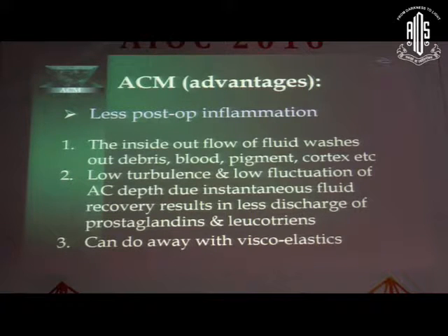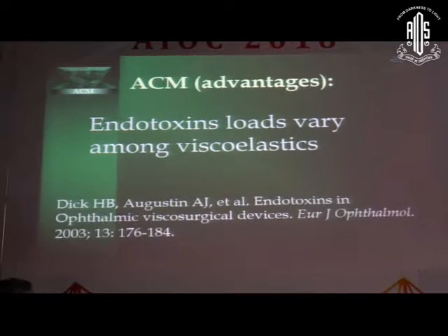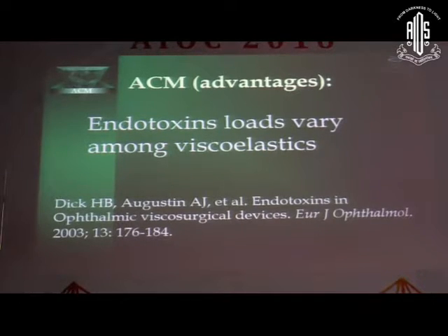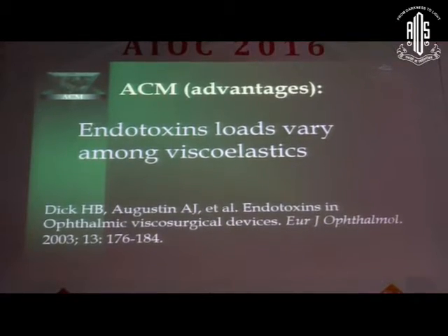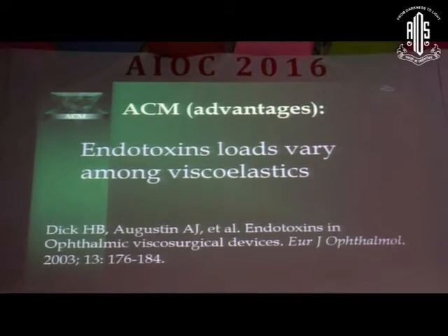There is less post-operative inflammation because there is always inside-out flow of the fluid. It washes out debris, blood, pigment, cortex, etc. There is low turbulence and low fluctuation of anterior chamber depth due to instantaneous fluid replacement, and this results in less discharge of prostaglandins as well as leukotrienes. You can always do away with viscoelastics, though it is not a must. Endotoxin loads vary among various viscoelastics as referred by this study. So you can do away with viscoelastics and the chances of TASS are very low.